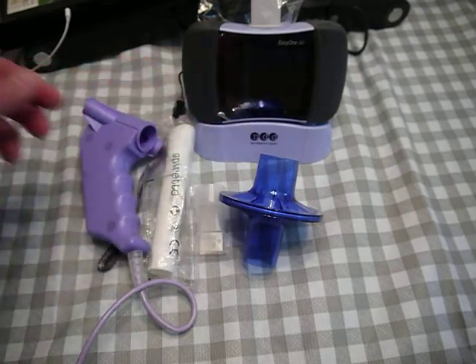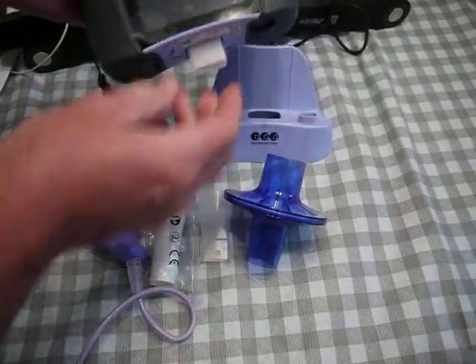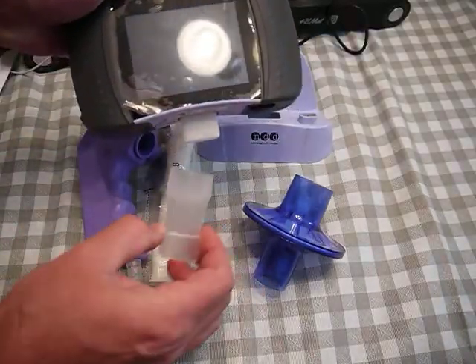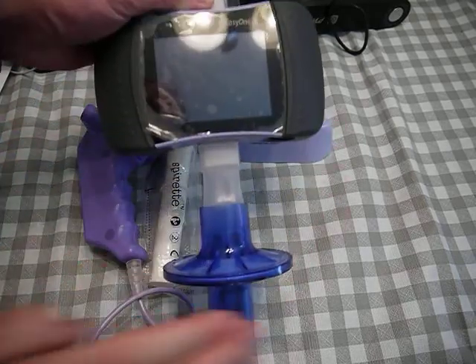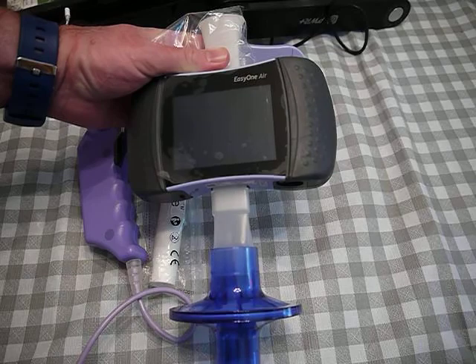To show how this goes into place on the Easy One Air, I have the flow tube already in place. I put the adapter into place and then I add the filter, and this all compresses together, and I'm ready to do my test.